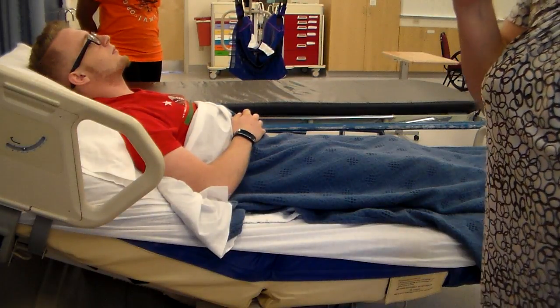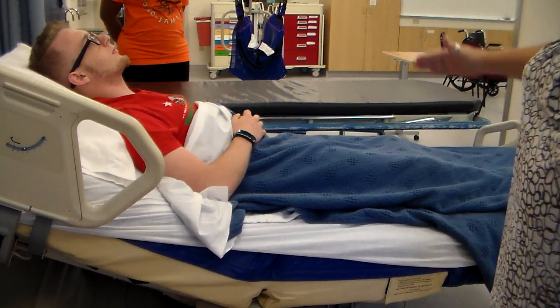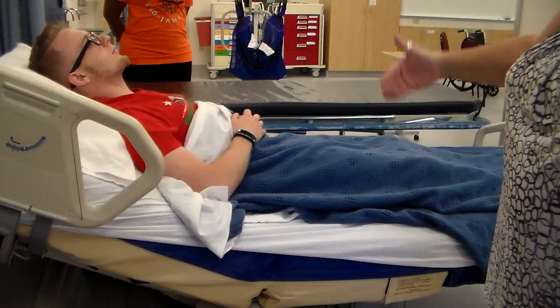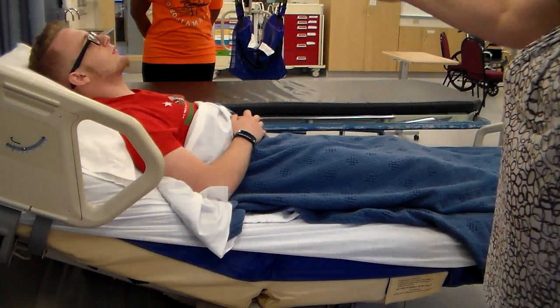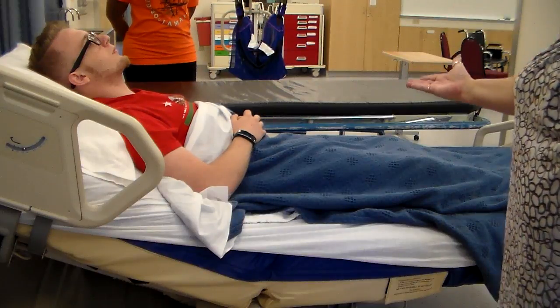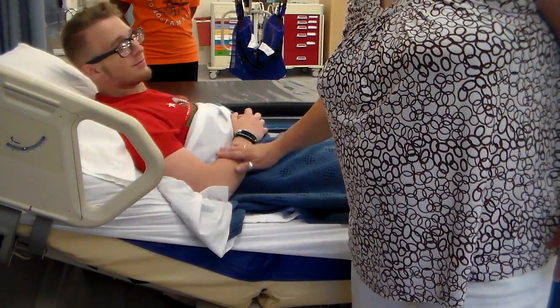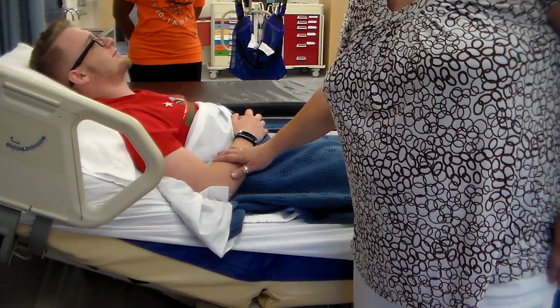For the purposes of this video, we're not going to put a sheet on that because I want you to see the difference from the bed to the stretcher. Okay. So generally you would put a sheet over that before you actually put a patient in there. Not a true patient. He's one of your fellow students. So he's going to endure this for you, okay?